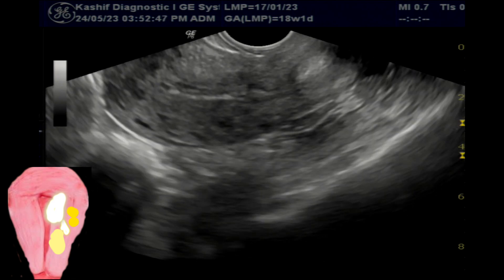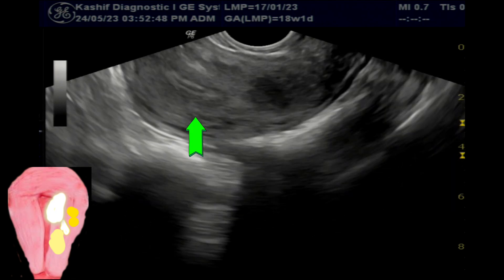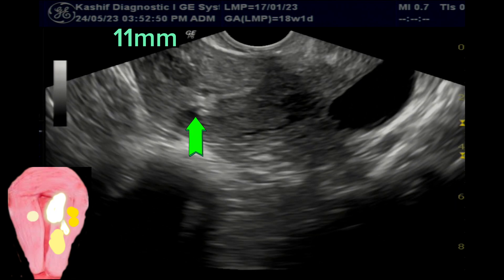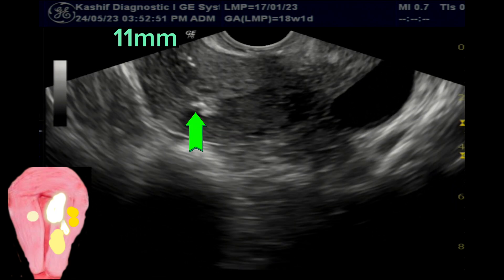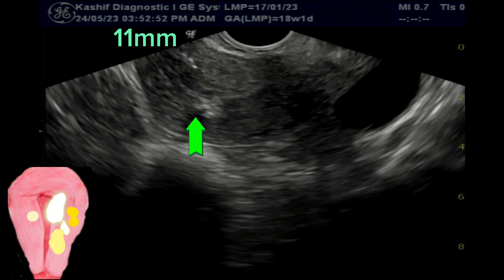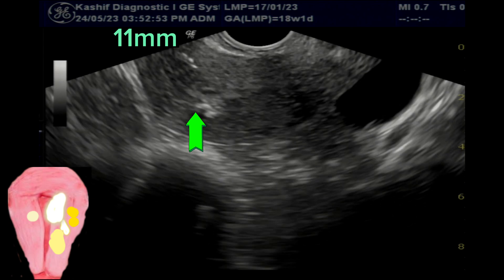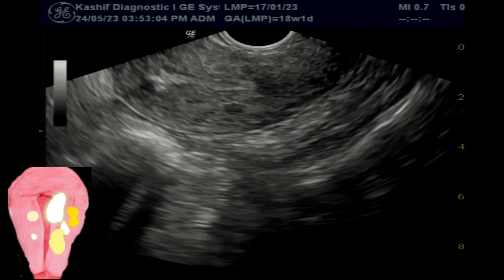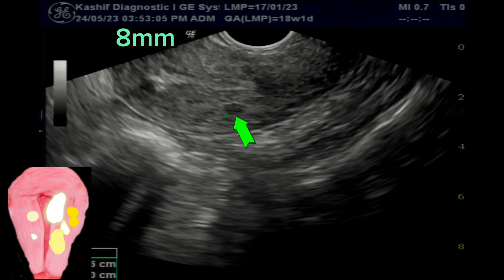Posteriorly, a calcification area and a small intramural type fibroid is seen. Although fibroids are benign, in this case these are causing complications.